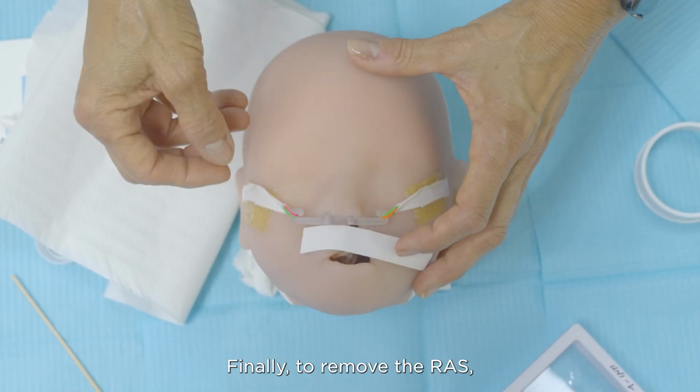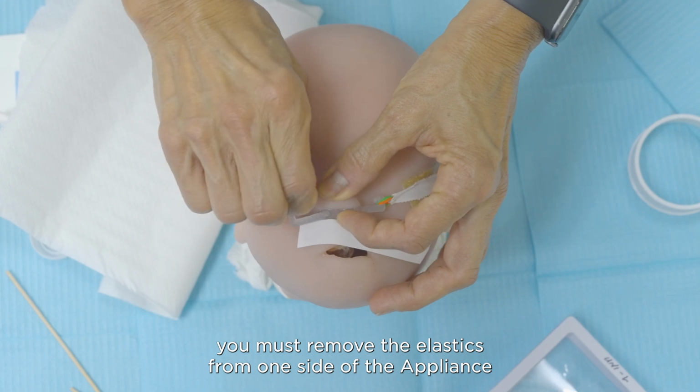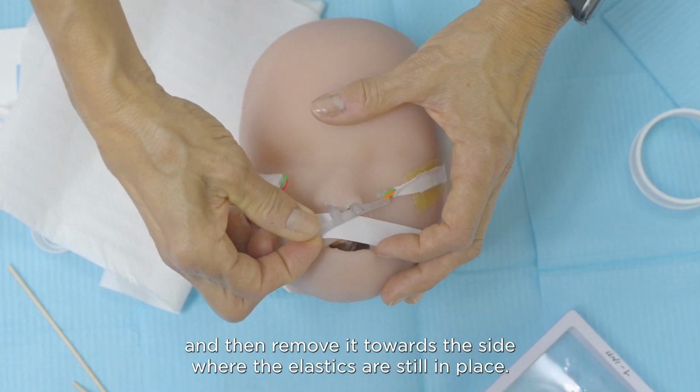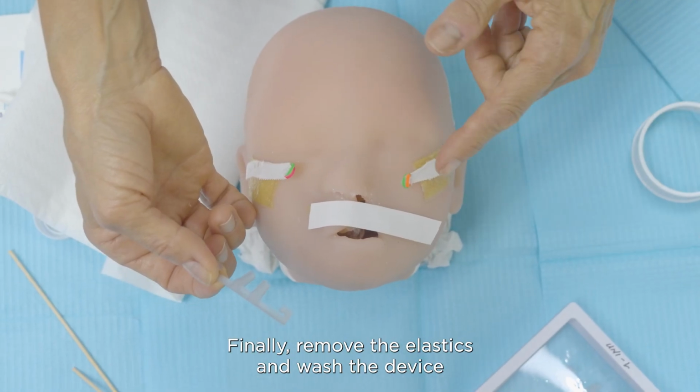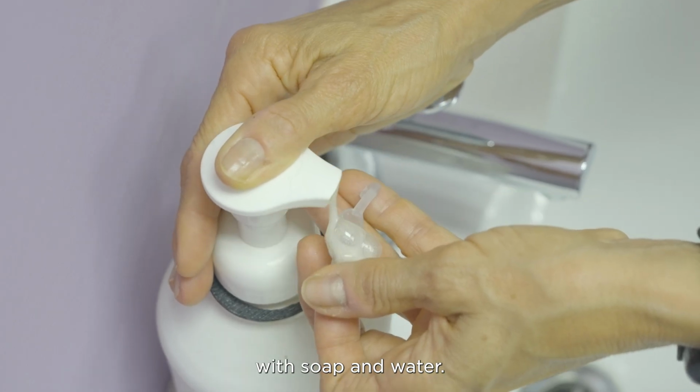Finally, to remove the RAS, you must remove the elastics from one side of the appliance and then remove it towards the side where the elastics are still in place. Finally, remove the elastics and wash the device with soap and water.